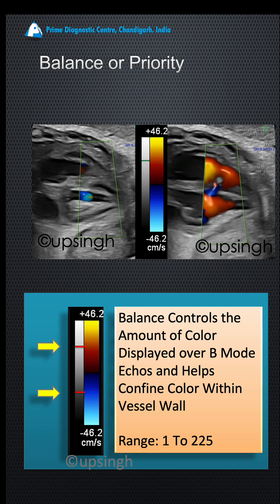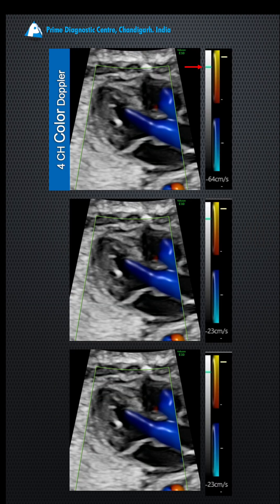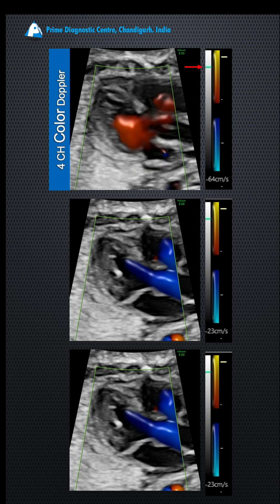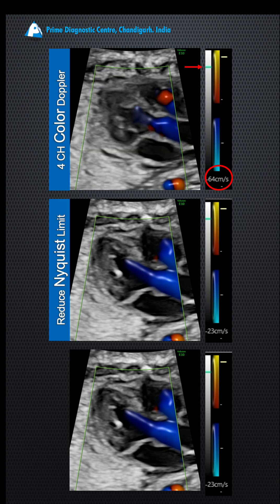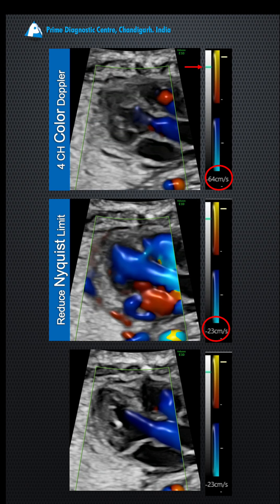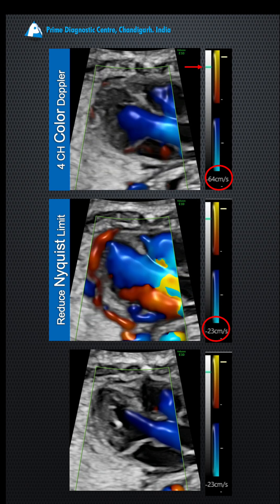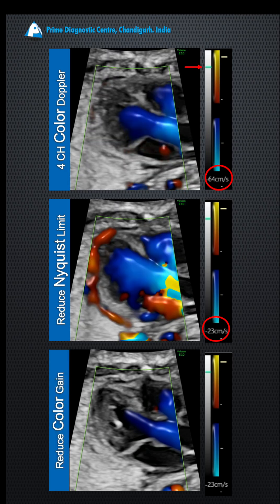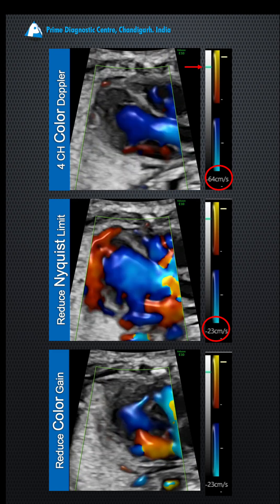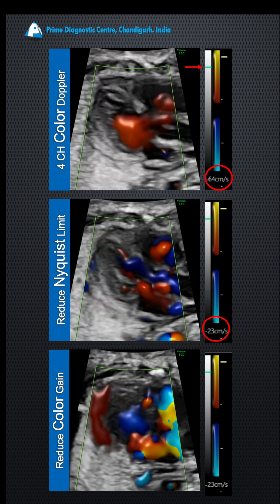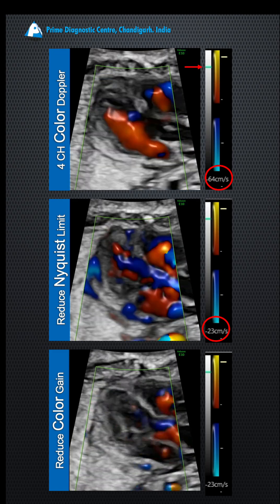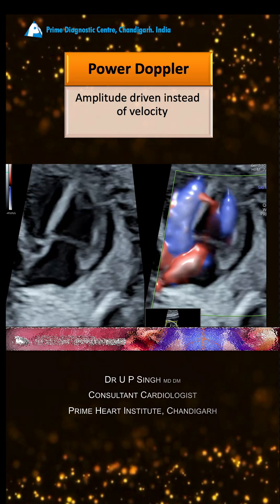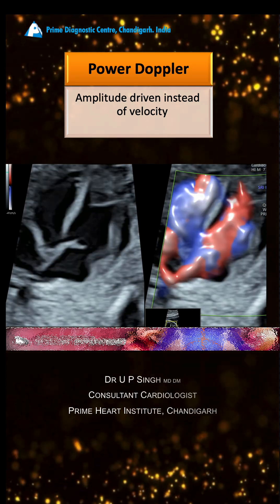Then the color flow will shine out of that VSD. The next step: since VSD is a low-flow phenomenon, you won't see it on a high velocity scale. Reduce the scale or Nyquist limit to a level where there is bleeding of color all across the area and things aren't clear — then rectify this by reducing the gain. Reduce the gain and reduce the Nyquist limit to get a good VSD flow.